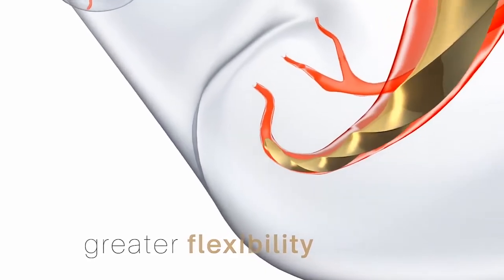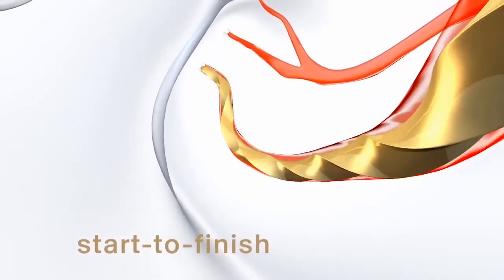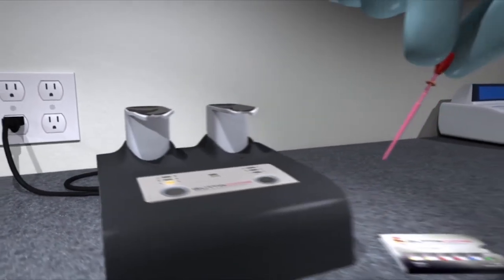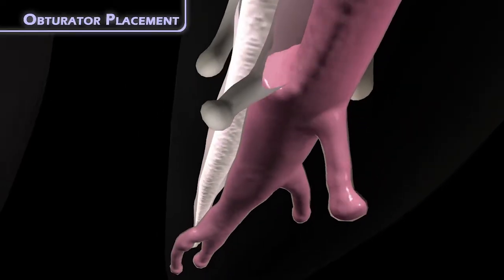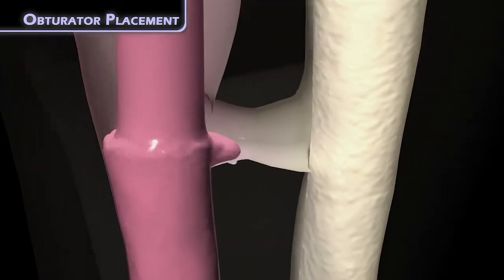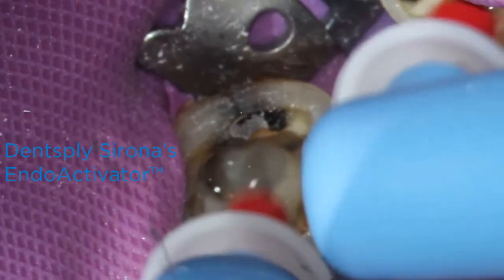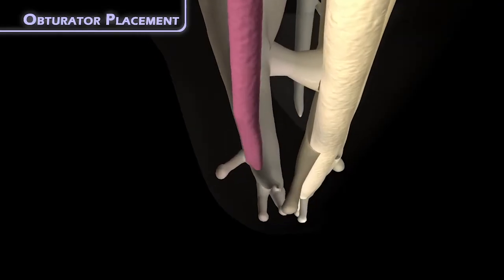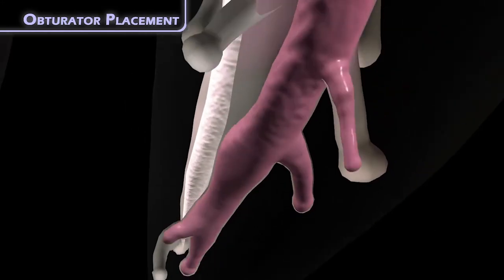I'm going to share with you an obturation tip that helps me overcome this problem. Before that tip, however, in my opinion, the most important factor in getting quality, dense root canal fills is establishing a proper glide path by removing dentin triangles and proper mechanical and chemical cleansing and shaping of the root canal system. I find carrier-based obturation to be the most efficient and effective way of filling a root canal system in my hands. Following proper cleansing, shaping, and debriding, I can better achieve a 3D fill of the canal system, including lateral and accessory canals and multiple portals of exit at the apex.